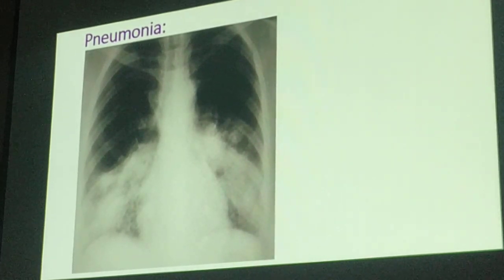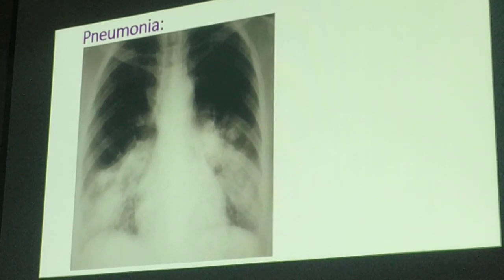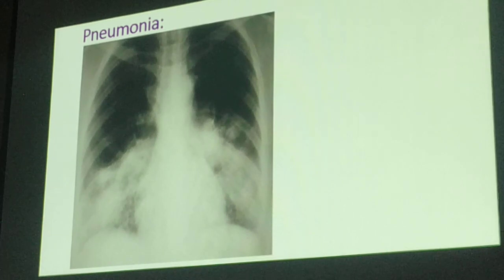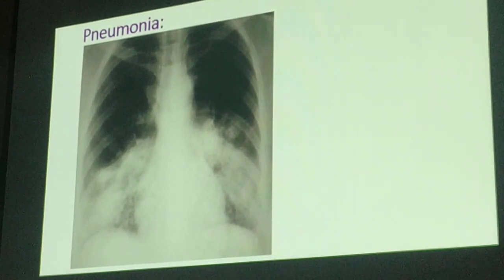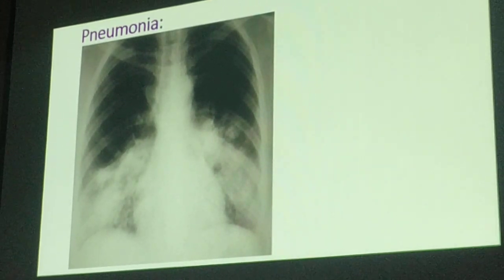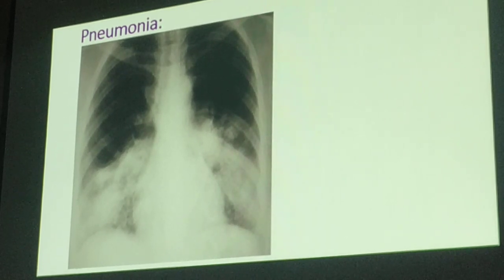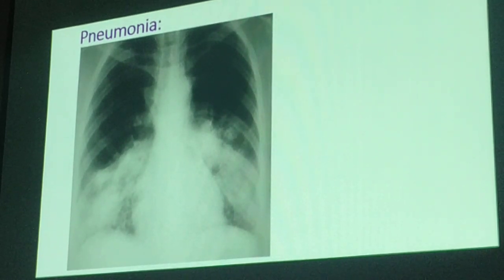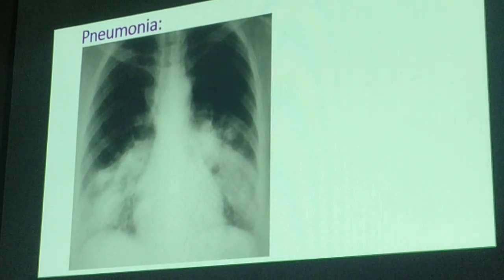Except for some drugs now, like azithromycin, it's only given for 3 days. You want to see if the antibiotics are effective. That's why you want to do a repeat chest x-ray, because you're expecting that there would be resolution of the consolidation. It should be leading more into blackish. It won't become whiter, it should become blacker. The consolidation resolves, then is replaced by air.